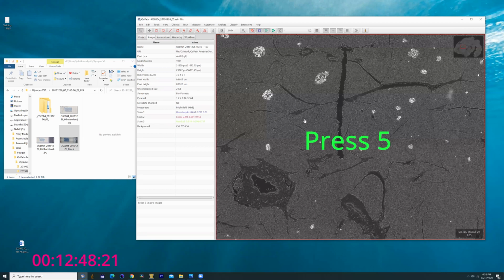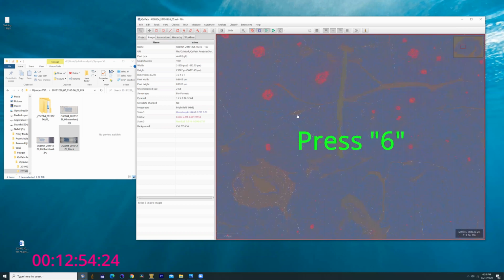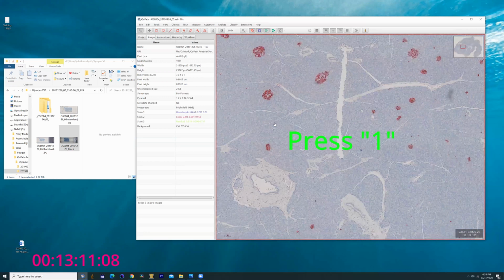There's also a high contrast on 5, which is basically just lights and darks. And 6 is like a counter overlap. It's sort of like a Gaussian blur where it takes the average of the color from that region and can be useful for distinguishing overlaps in color, say, for dual staining. But for H&E, right now it's a pretty straightforward 2-color comparison. So let's go back to overview.